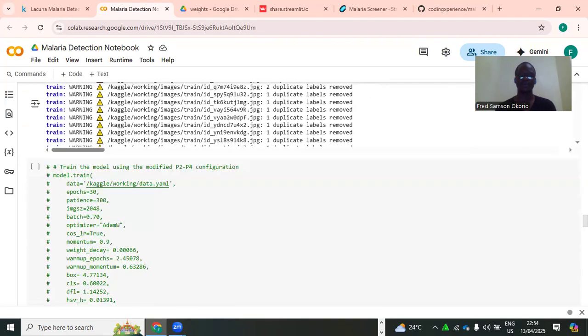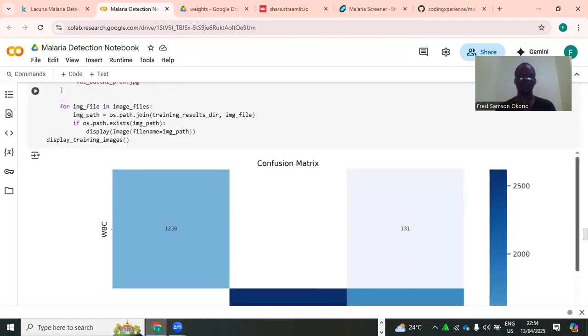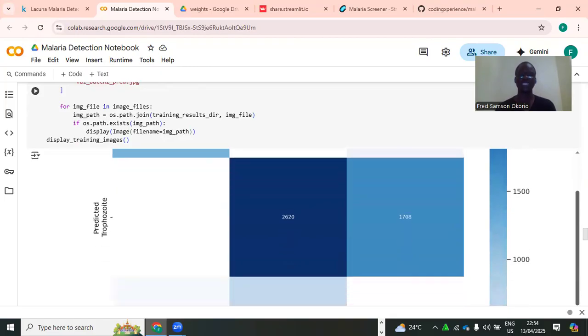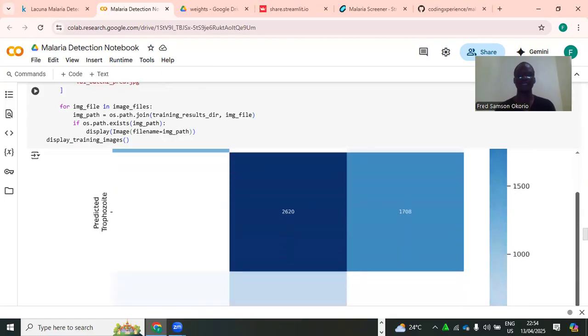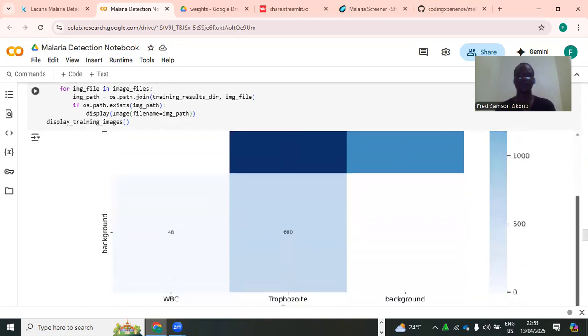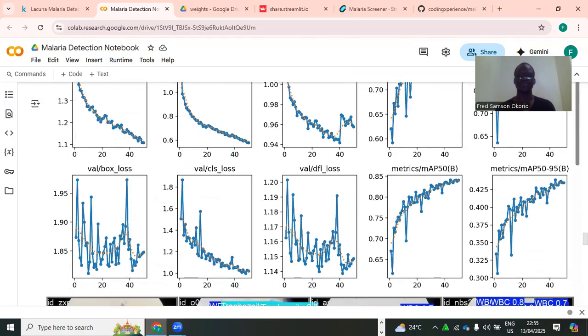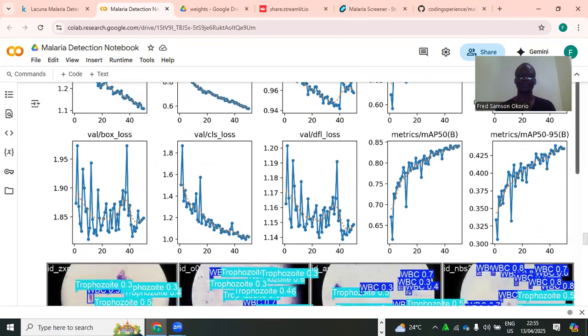As you slope down here, this is a confusion matrix. When you look through the confusion matrix, you can see that there's a lot of misclassification here. The model is not perfect. It's doing good, but there's a lot of work that needs to be done here. You can see all those details, the artifacts, all those. I'll be sending them right through.